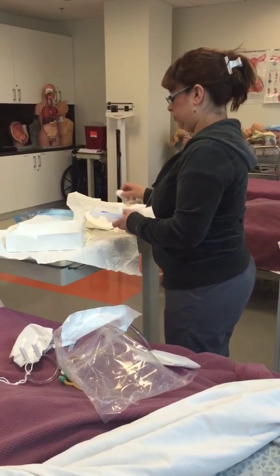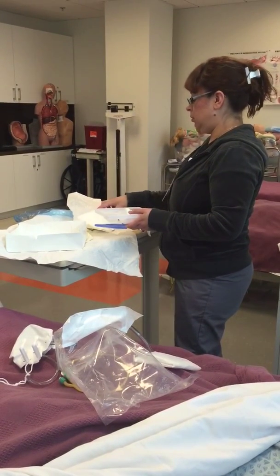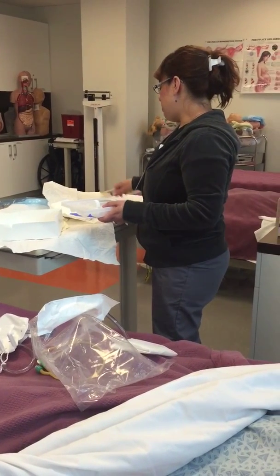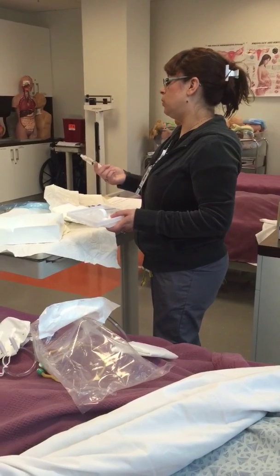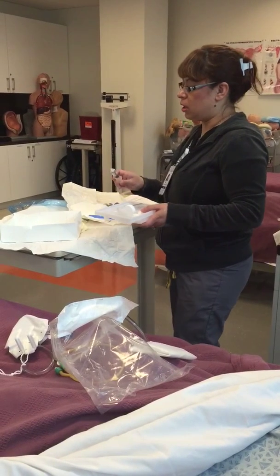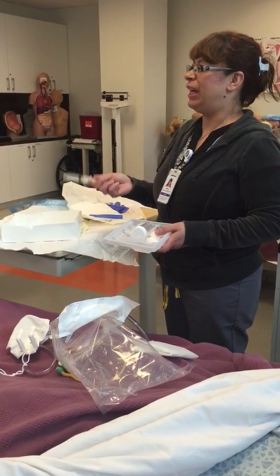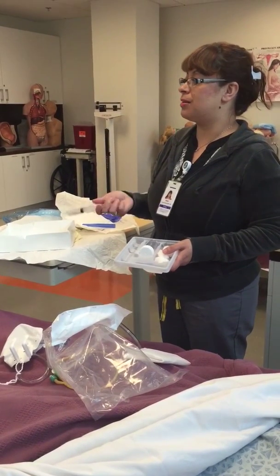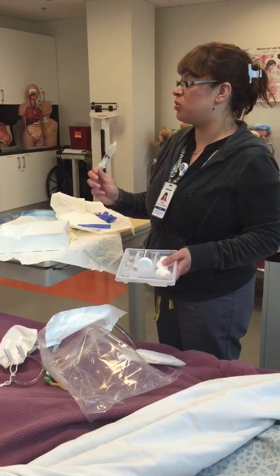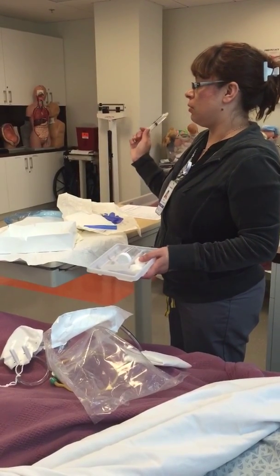Yes. When we remove the fluid, when we remove the catheter, why are we not pulling it out with the syringe? They say by gravity is best because the balloon has been in there inflated. And another thing I forgot to tell you guys, make sure that you fully take everything out. People get creative at work and think that by inserting more, it won't leak. I have pulled this out and there's been almost 15 cc's of saline. So you want to pull out and make sure that everything is out.